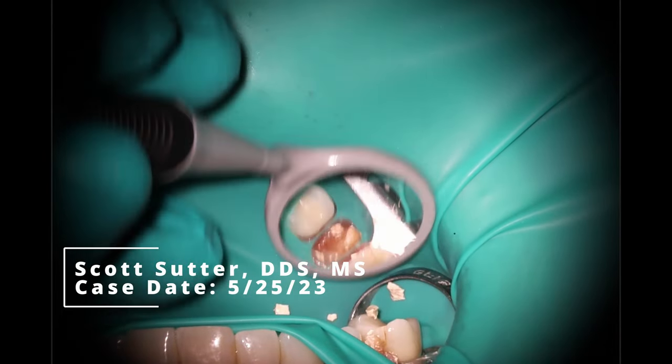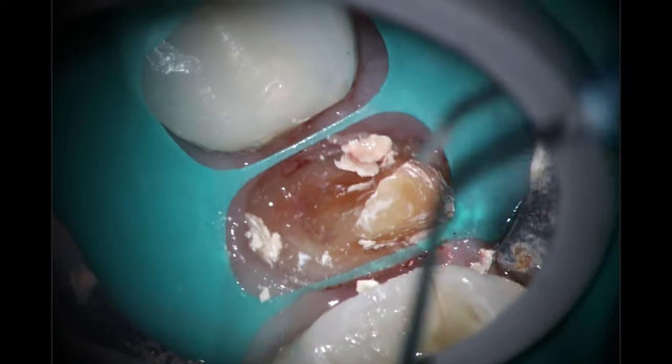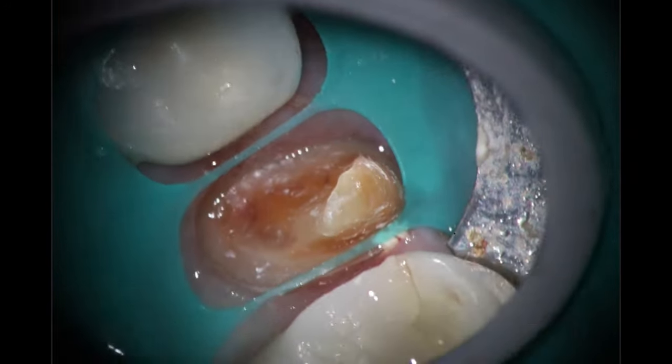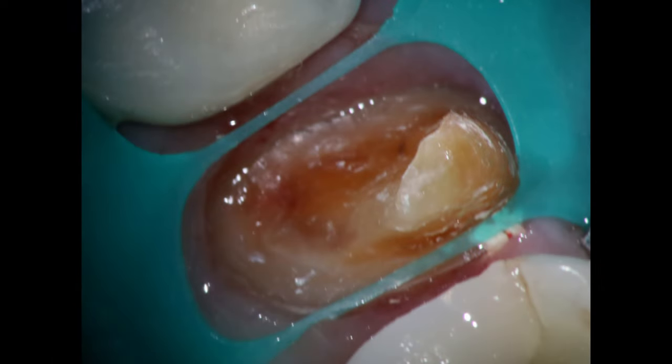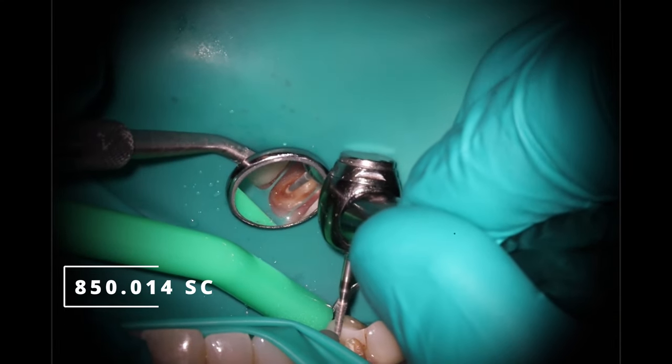This is going to be a really straightforward root canal with a kind of complicated buildup scenario. It's not really that difficult of a case from a root canal standpoint, but to get this tooth looking nice and beautiful, you'll see what we do. Pop that temporary crown off. The dentist told me not to worry about doing a new temporary. I ended up using the Glickman clamp because there wasn't a ton of tooth structure to grab onto.